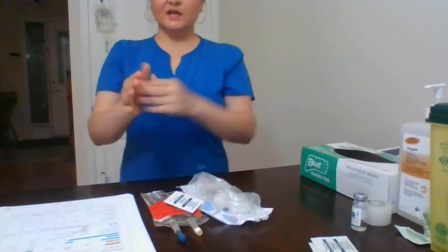Okay, so the first thing I will do is, for my patient's privacy, I will close the curtain and I will make sure that my patient is comfortable, and I will meet my patient. Good morning, Mr. PNL. I'm Camila, your nurse. Dr. Markham has ordered pantoprazole medication for your stomach to reduce your acidity and make you feel better. Do you have any questions right now?